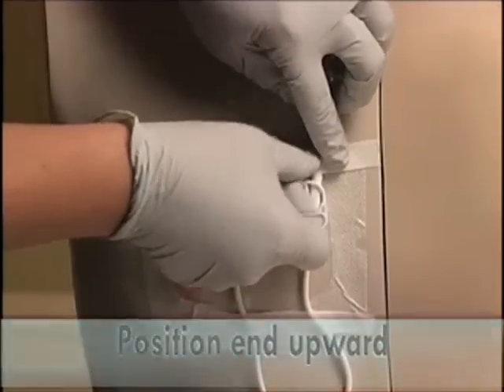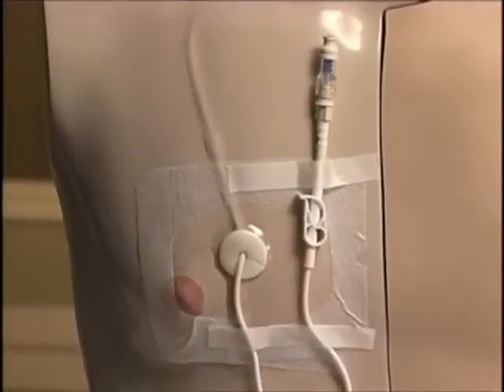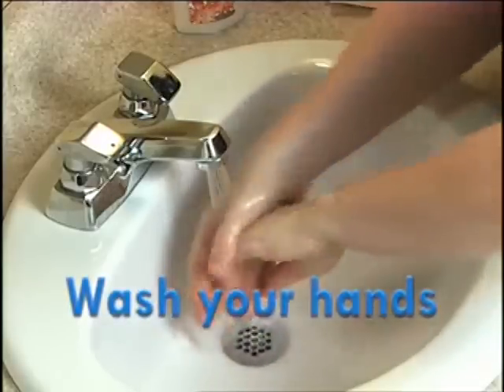This will secure the tubing to help prevent excess tension on the tube and reduce the risk of dislodgement. Wash your hands.